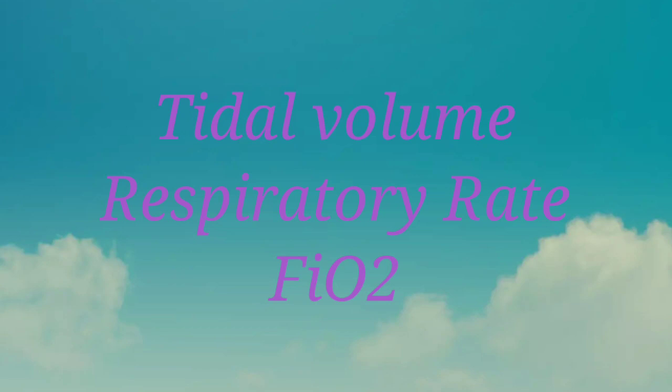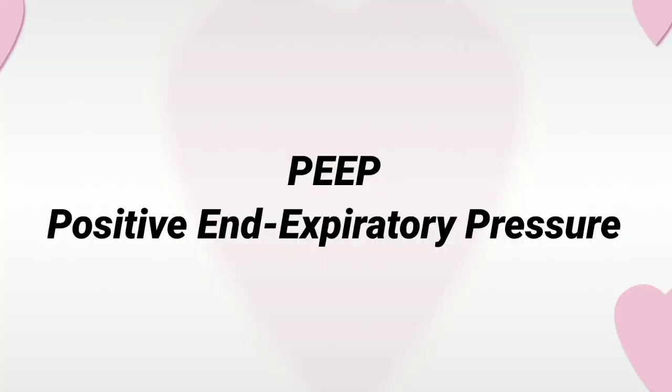So up till now we have set tidal volume, respiratory rate and FiO2, or fraction of inspired oxygen. Another very important parameter which we set in patients with ARDS, which so many of these COVID-19 patients develop, is the PEEP, or the positive end-expiratory pressure.